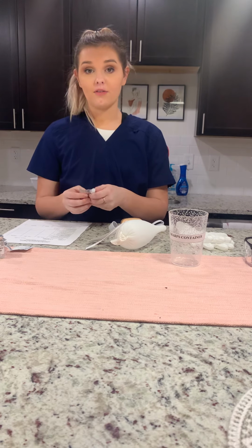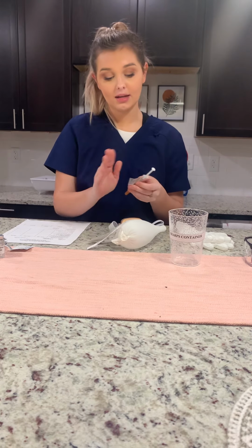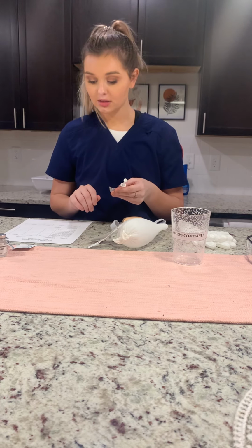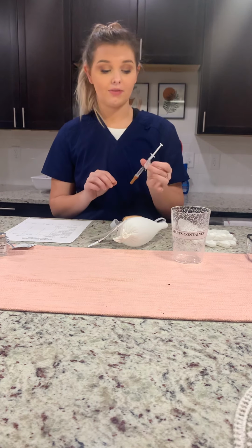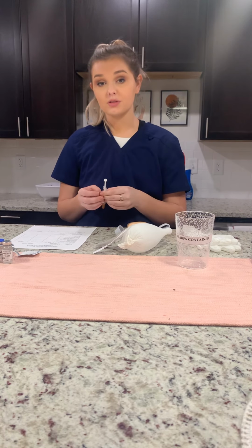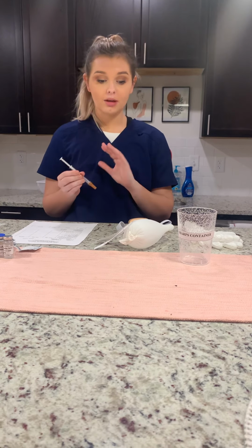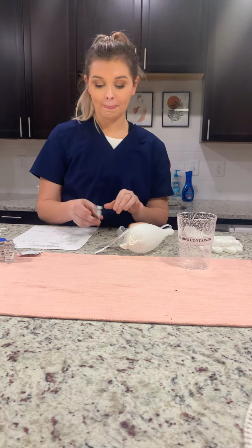And we are going to verify one more time everything with the MAR, the armband, and the dosage. We have Jaguar Jones. We have heparin 5,000 units subcutaneously every 12 hours. And here I have it right here, heparin 5,000 units given subcutaneously. It has been 12 hours since his last injection, so it is time for another one. Mr. Jones, I'm going to give you a heparin injection today. It's a very small needle. It won't take me just a second, and it shouldn't hurt, but just a little bit.